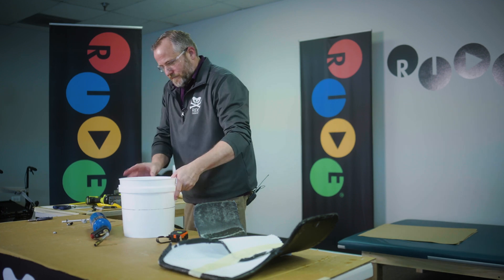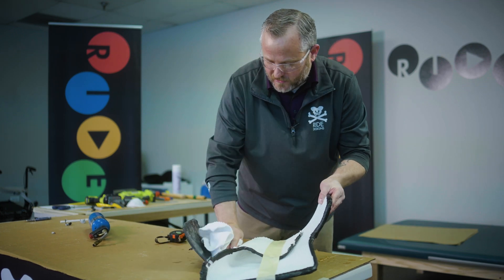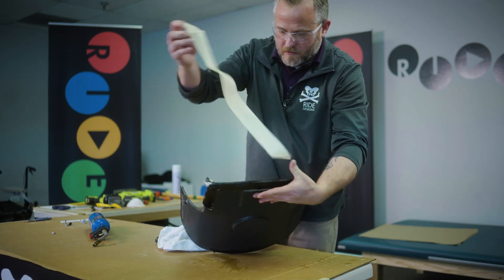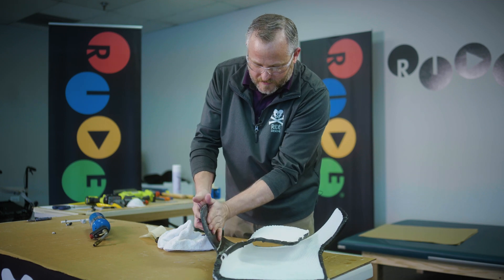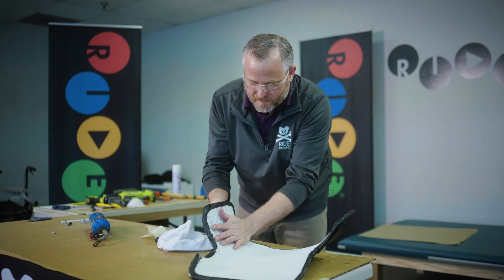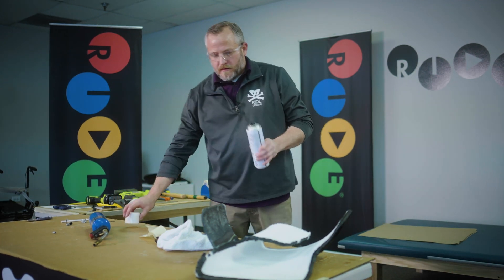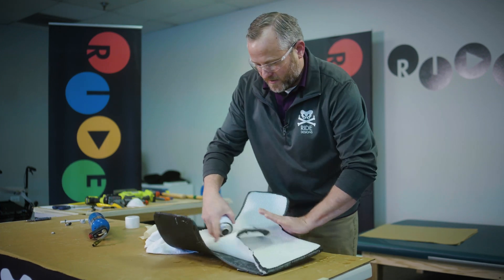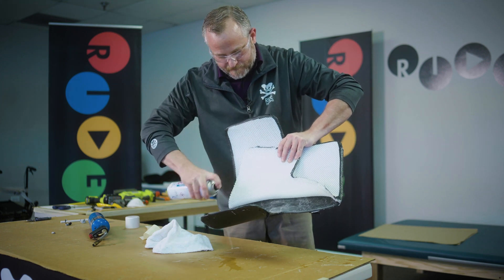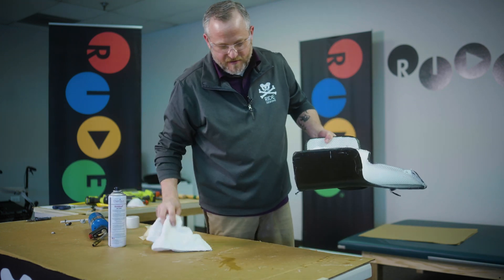You want to dry that off because I'm going to re-glue my material. There is some residual glue but not a whole lot. You might be able to get away with just laying it back in there and re-taping the edges, but you can use some spray glue and hit both sides of this and let that sit until it becomes tacky — about 30 seconds usually.